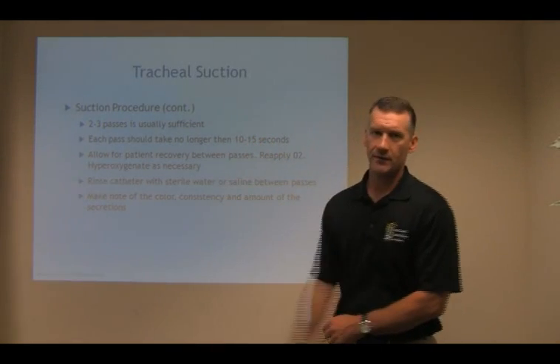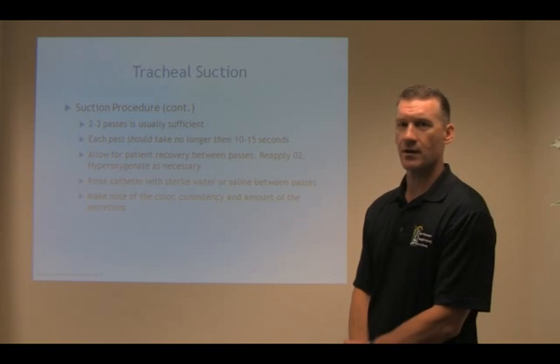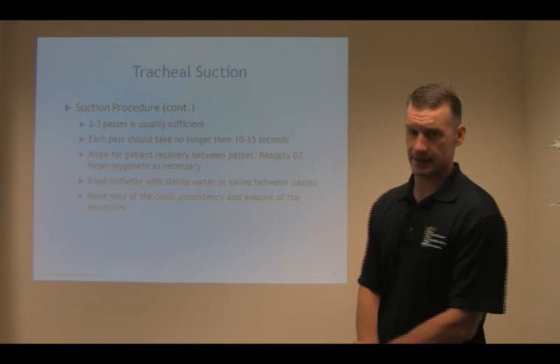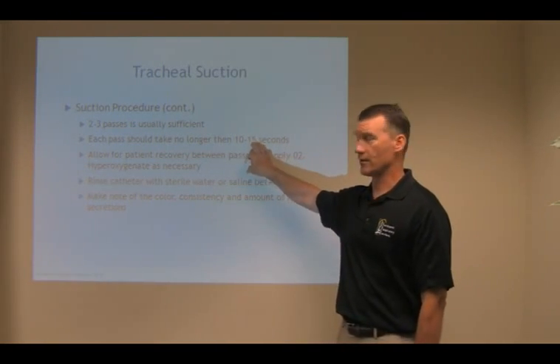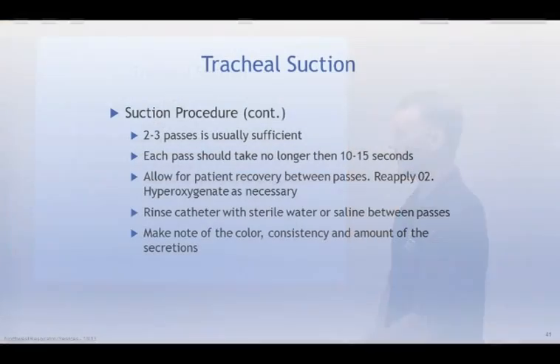What I tell all of my nursing staff when we're suctioning is that when you apply suction, you hold your breath. And when you need to take a breath, they need to take a breath, because you're sucking all the air out of their lungs. And 10 to 15 seconds is a long time to be down in the resident's lungs suctioning with the catheter. And make sure that we always allow time to let that resident recover. Reapply O2, hyperoxygenate if necessary.